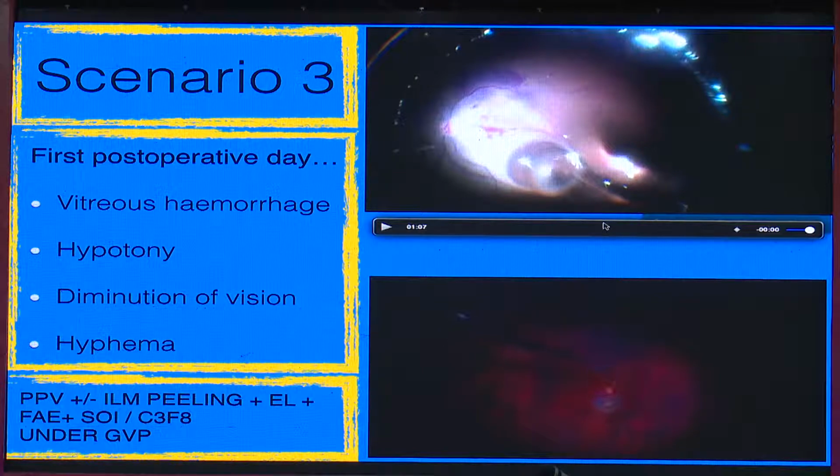Then we had the second one, and you can see how posterior it was. A third one was next to the bridle injury, and then I lasered the whole thing, put oil and closed it. Prognosis is usually good if we take it early, because if we remove the toxic agent, I think that is the key factor.